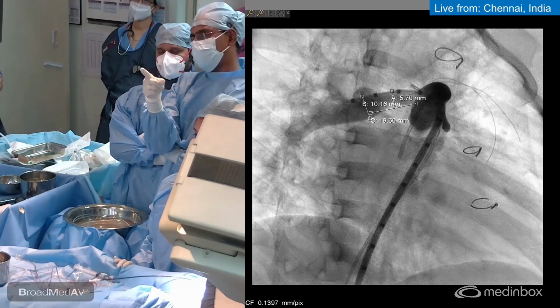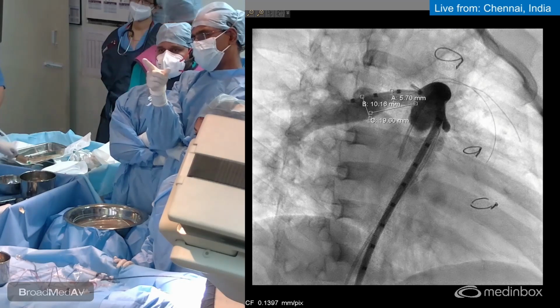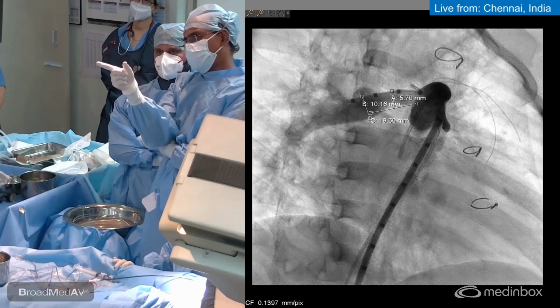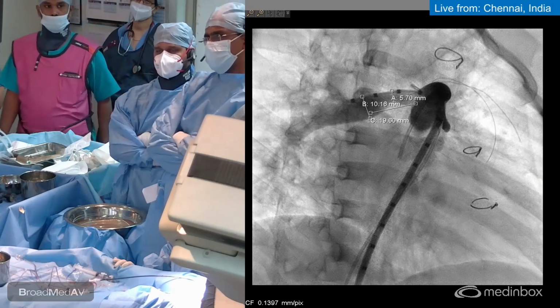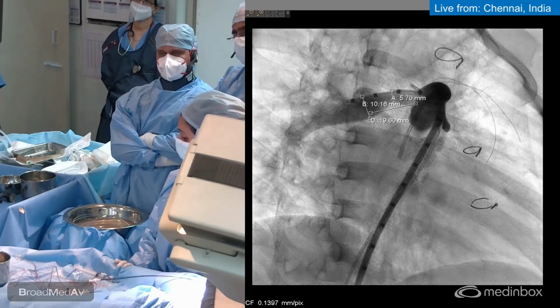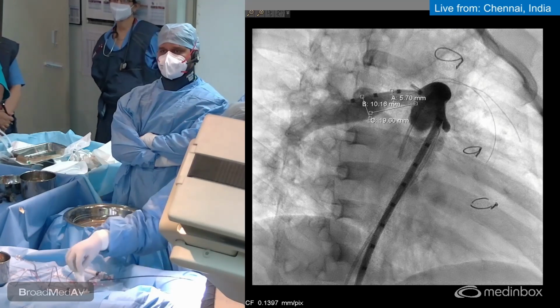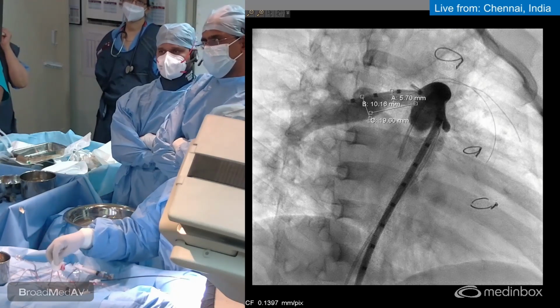So we need probably a 3 centimeter stent on the right pulmonary artery. This length is sort of foreshortened. We are able to appreciate that the 3 full markers are there across the entire right pulmonary artery. So we need a stent that is about 3 centimeters on the right, and which can be dilated, which can go up to say around 10 millimeter.